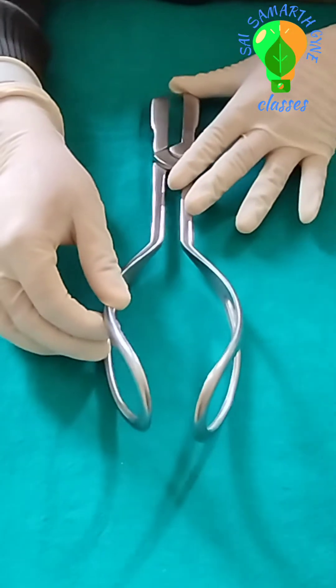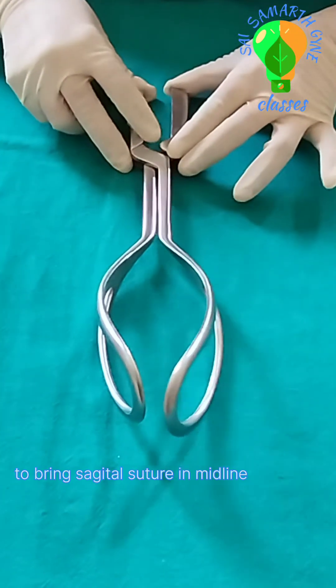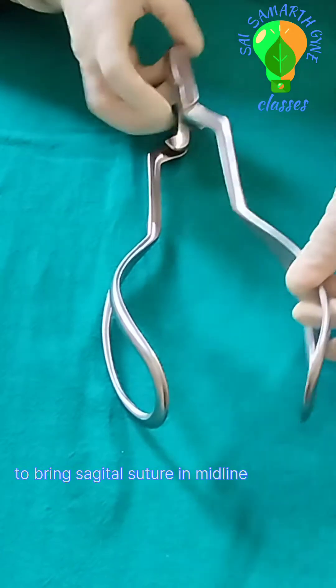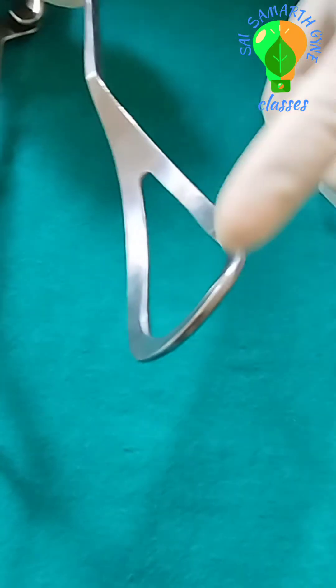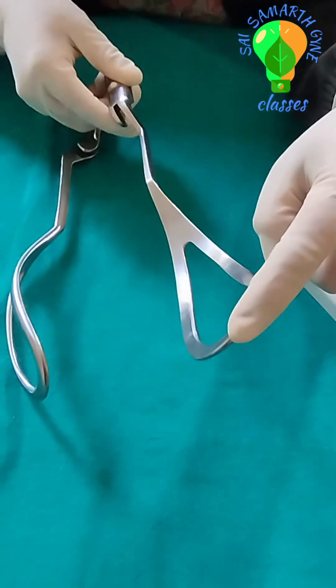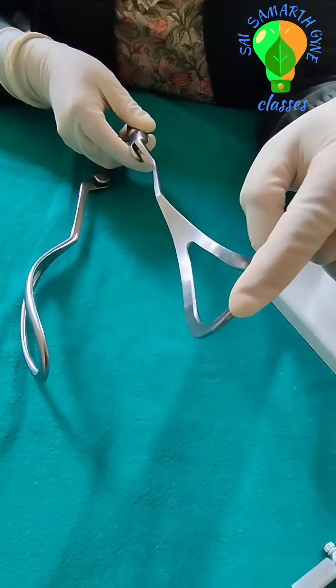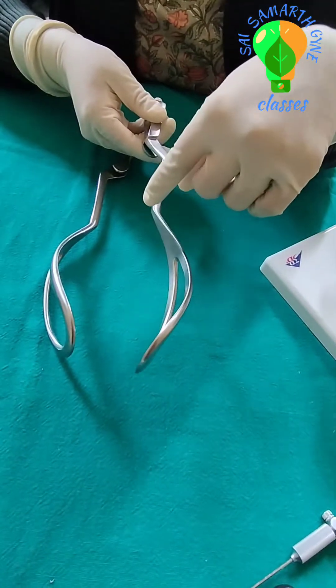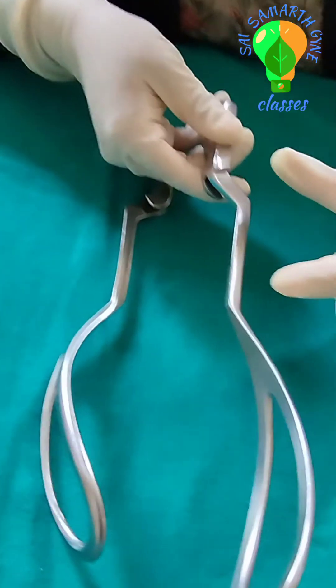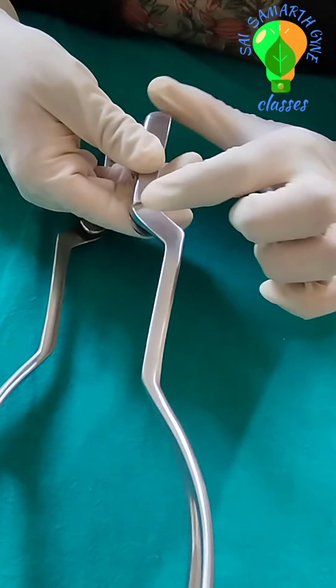Here you can see the parts of the outlet forceps. This perforated portion is the blade. This is the toe of the blade. Here, this is the heel of the blade. This part is the shank and this is the handle.